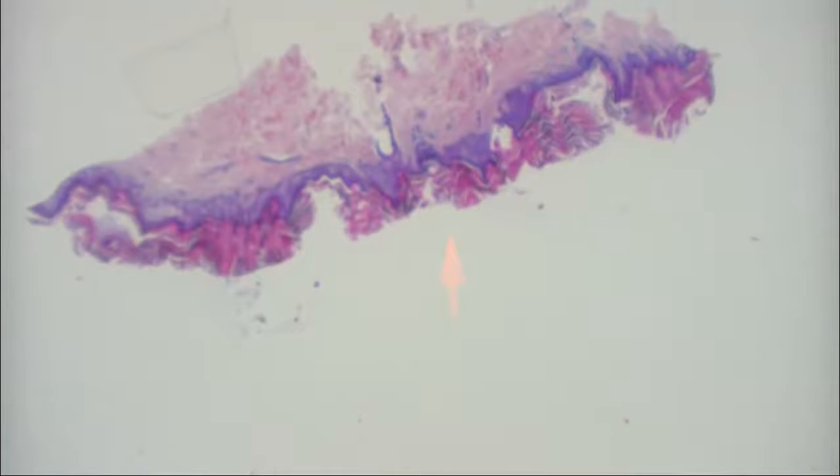So this one was a shave biopsy. Good. I thought that there was something going on in the stratum corneum. So there was like lamellar hyperkeratosis, and then I thought I saw maybe a dermatophyte or spaghetti and meatballs in some parts. And in the highest one of the cuts, there was a larger circular structure that looked non-human or foreign, and I wasn't quite sure.